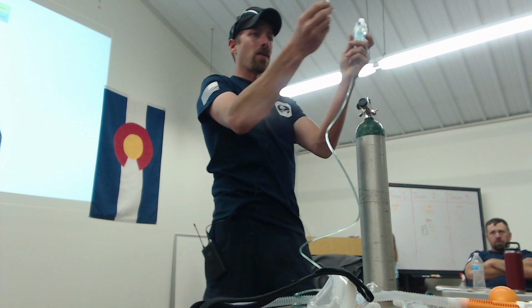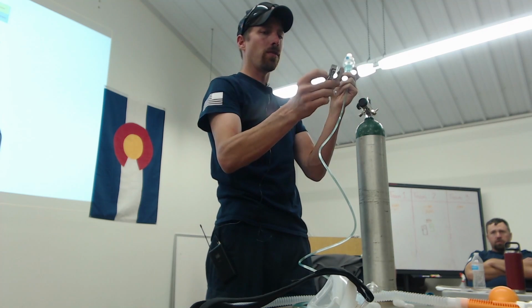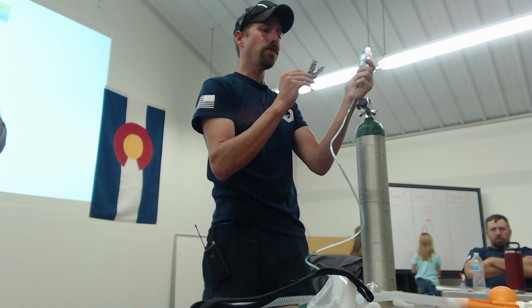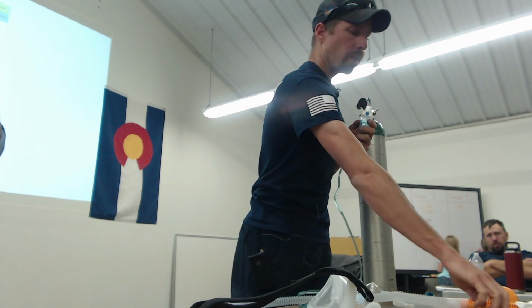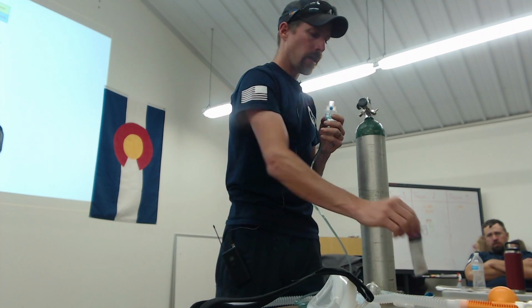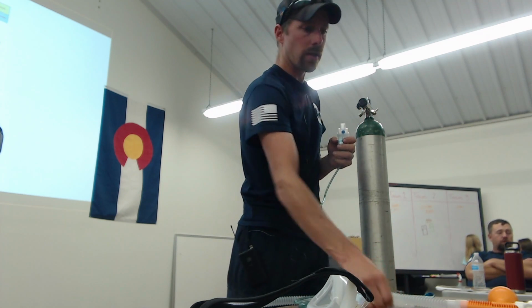Of course, that wasn't enough. This is one of the albuterol treatments. It's only in the 0.5 milliliters, so what do we got to add to it? We need another 2 milliliters because this was a higher concentrated dose. The more recent ones that we got in, this was when we kind of had an albuterol shortage, and these were what I could get. But the new ones that we've got on the rig, we were able to get the correct liquid amount.